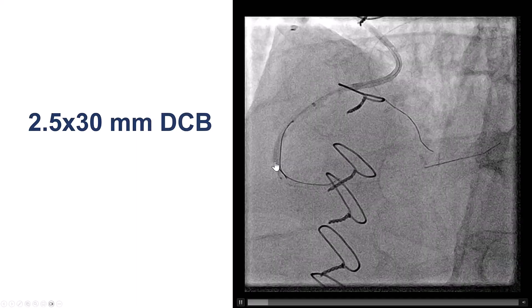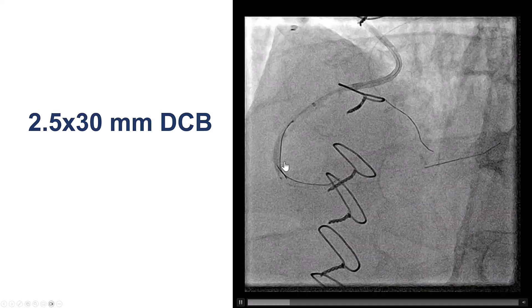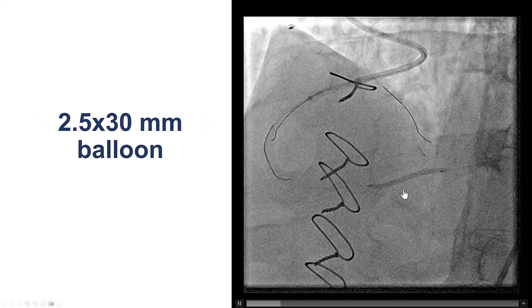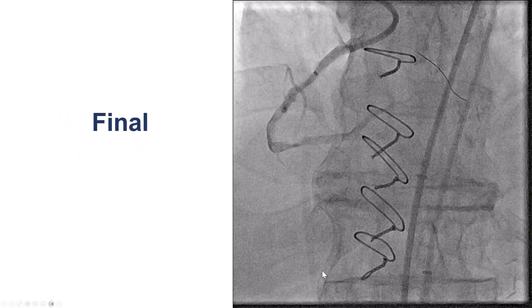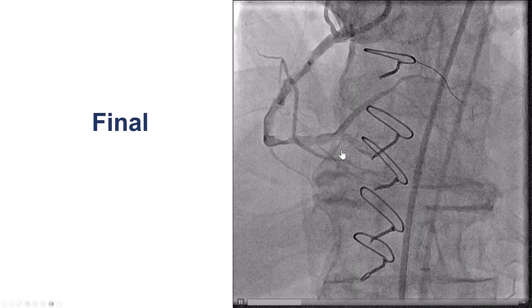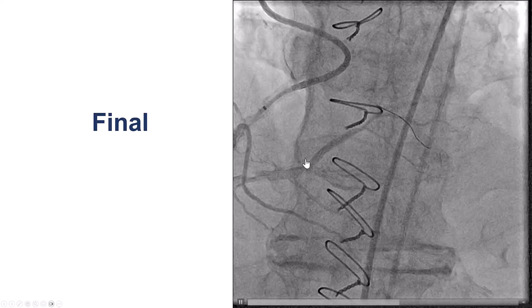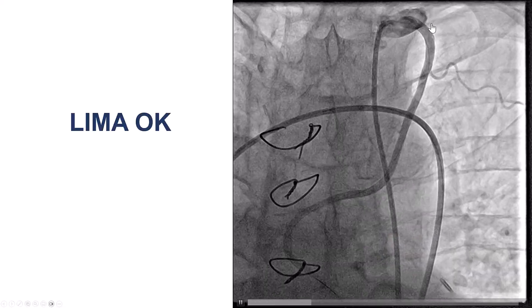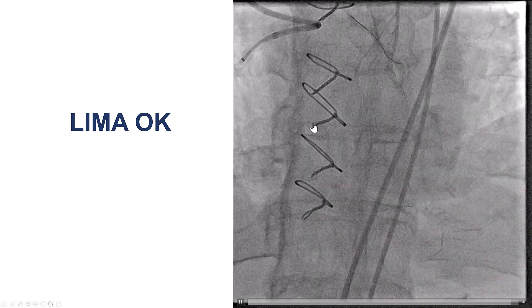We used a drug-coated balloon. The original plan was to go all the way down using a drug-coated balloon throughout the vessel, but delivery was challenging, so we applied the drug-coated balloon along the proximal cap and used a regular balloon into the posterolateral and distal right coronary artery. The final result showed TIMI flow into the posterolateral and that small first PDA, but no flow into the main PDA. We checked the LIMA during contralateral injections and it was fine without any injury.